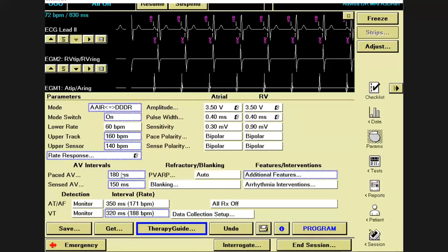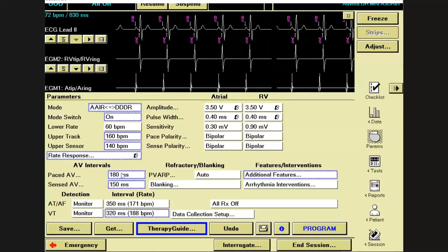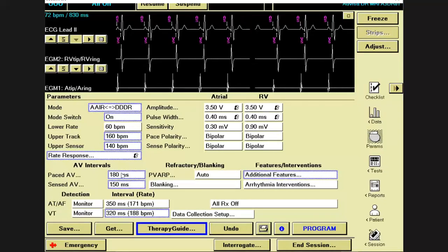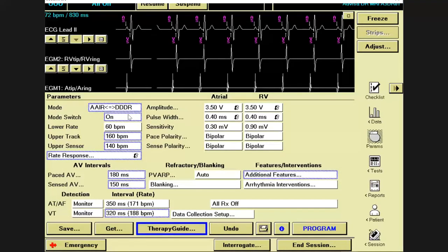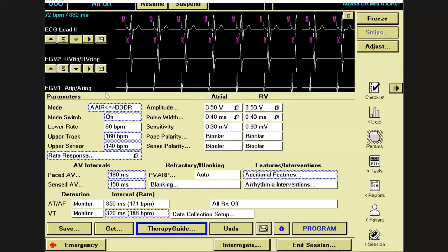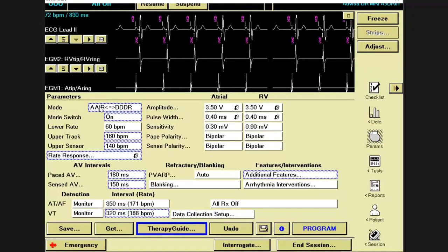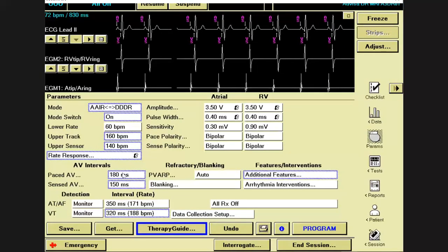Once again, this is a very arbitrary value that is being programmed. The normally accepted nominal value is 180, which is clinically okay for most patients, unless you really want to titrate and spend time on that. In this case, that's really not a matter. So if you program an MVP rate response pacemaker, and a patient has reasonable AV conduction, and you want to pace all the time in the atrium, with intermittent AV block, then program MVP rate response, normal AV interval of 180, 200 millisecond, which is okay.